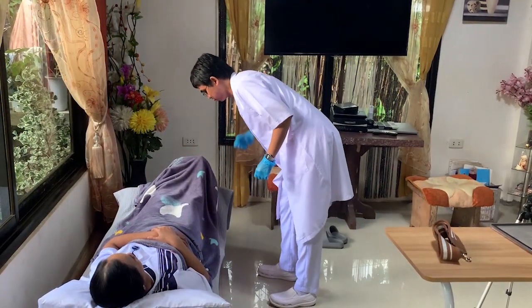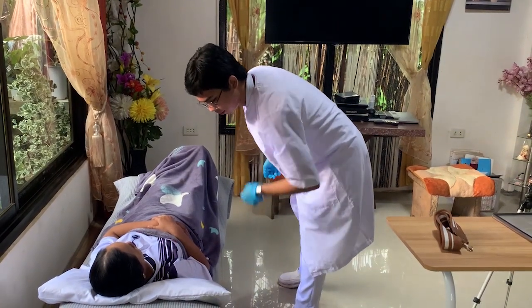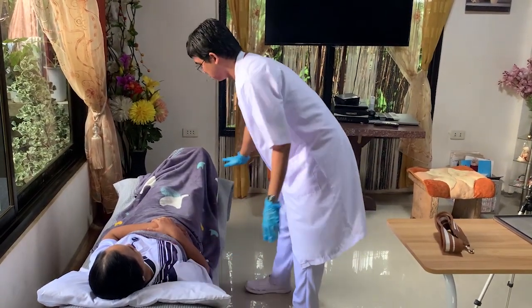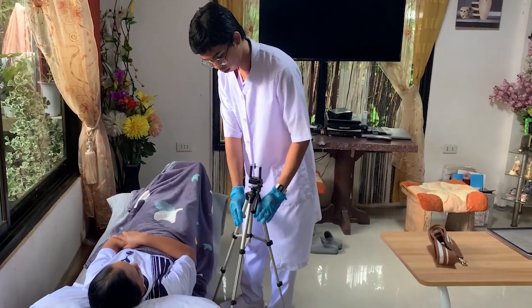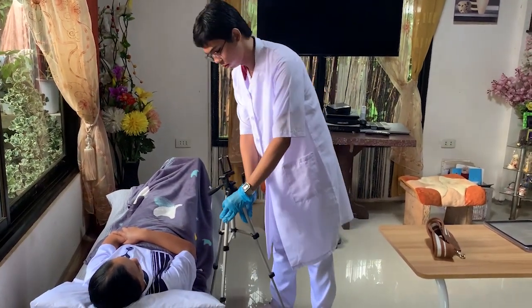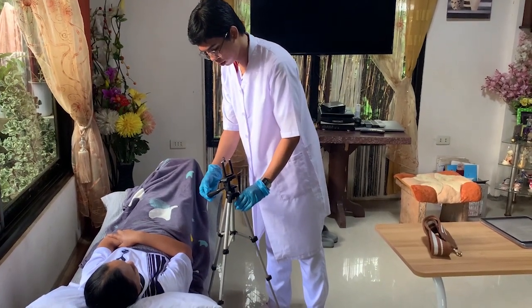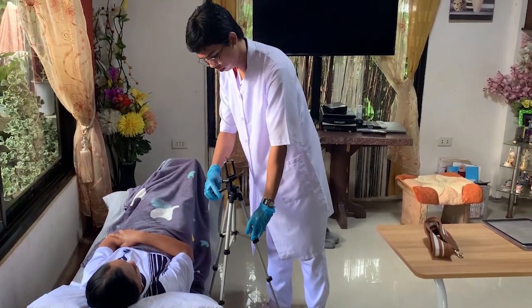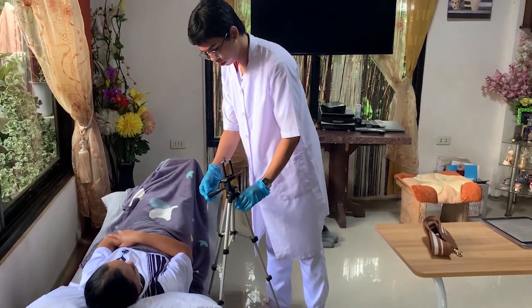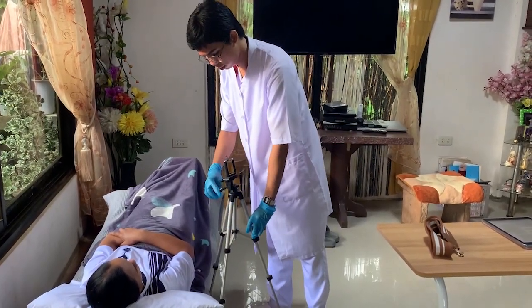Going to place the bed in a lower position. Proper bed height ensures safety when getting the client out of bed. Encourage the client to make use of a stand assist aid, either freestanding or attached to the side of the bed, if available. To move to the other side of the bed, assist the client to the side of the bed if necessary. This encourages independence, reduces strain for staff, and decreases the risk for client's injury.